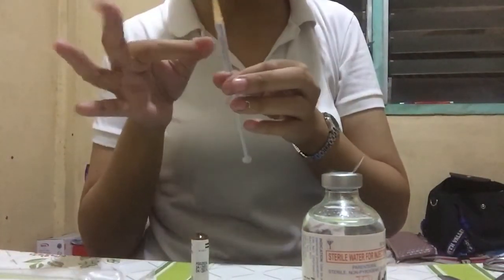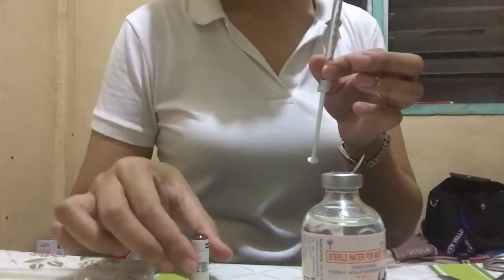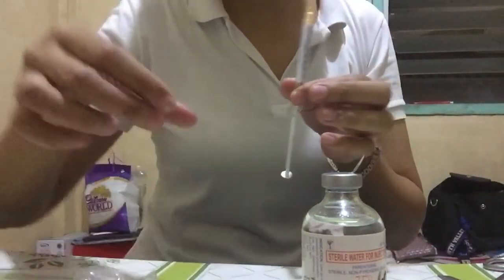Avoid any air inside the syringe so we don't inject air into the patient.